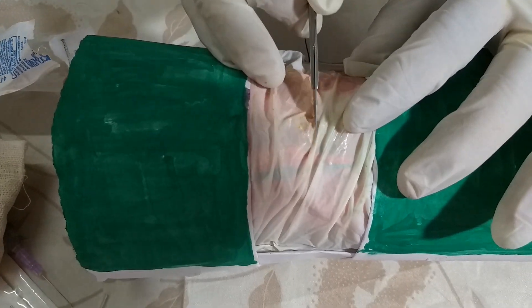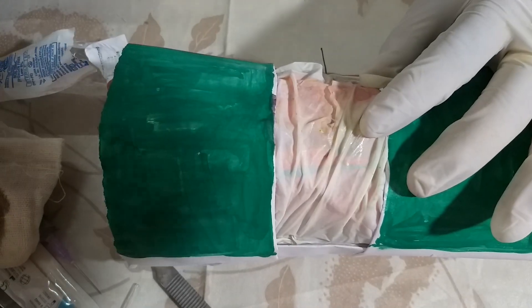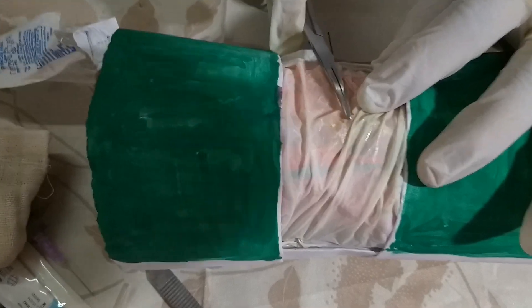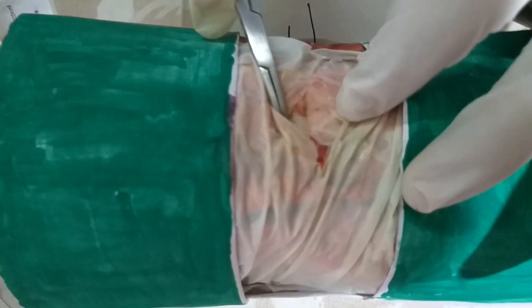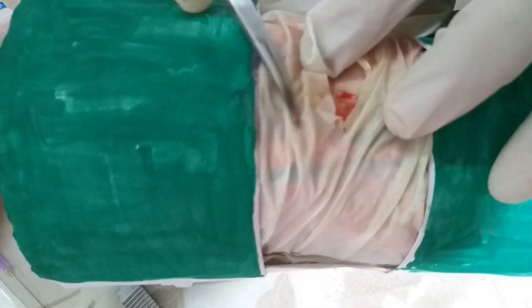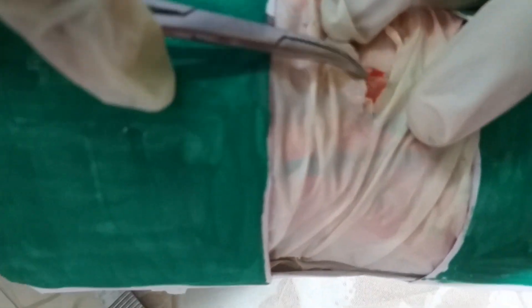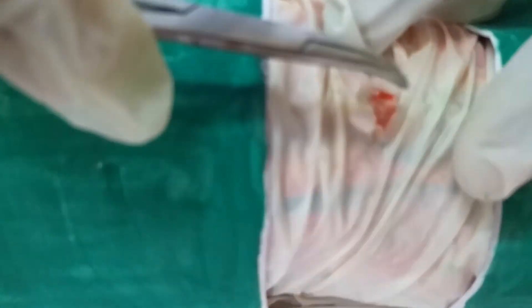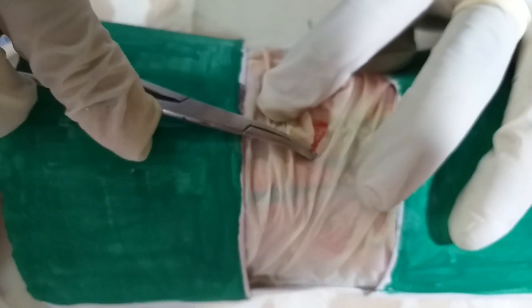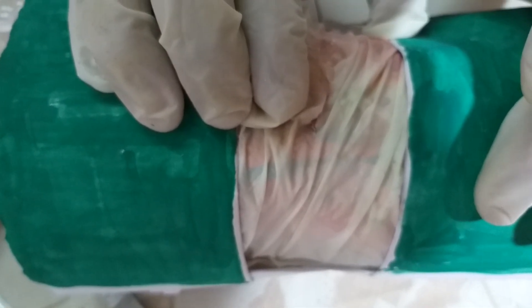Now take a mosquito clamp and dilate this area to expose the vein. After piercing the skin you will have subcutaneous tissue — just remove the fat. Once you can see the vein, note that lateral to the vein there will be an artery. To confirm whether it is a vein or artery, put your finger and feel for pulsation. If pulsation is present, it is the artery; otherwise it is the vein.